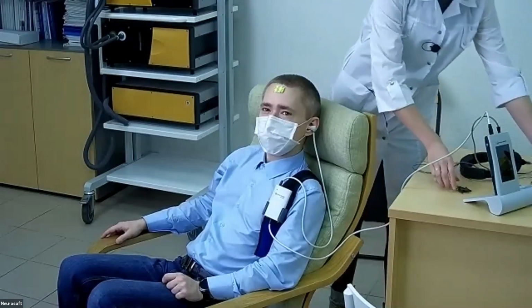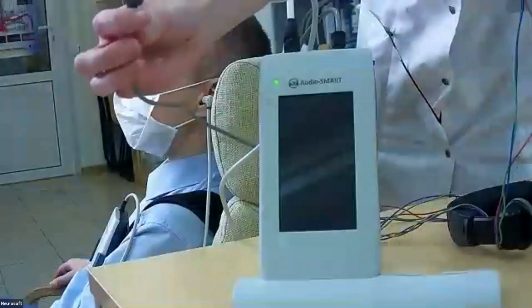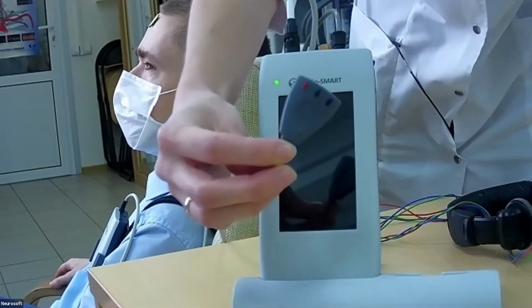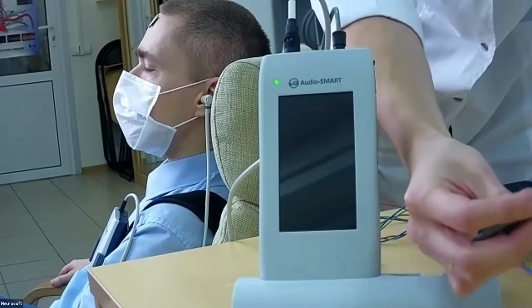So we see that this adapter has color coding for connection. So I connect the cables according to their colors.